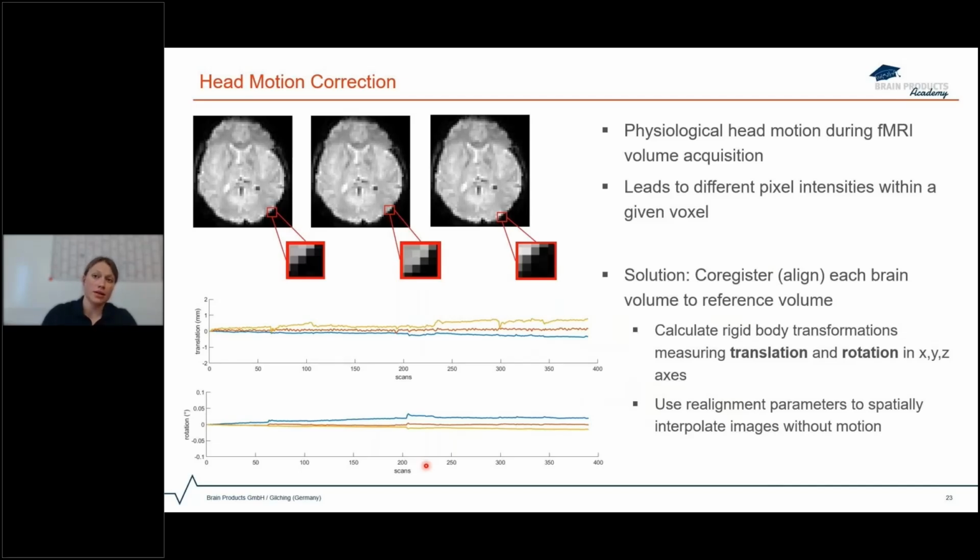And we should consider maybe removing that section of the data in our fMRI data. If we choose to remove it from our fMRI data, then we also need to consider removing that from our EEG data, as we possibly will combine that data at a later time point.